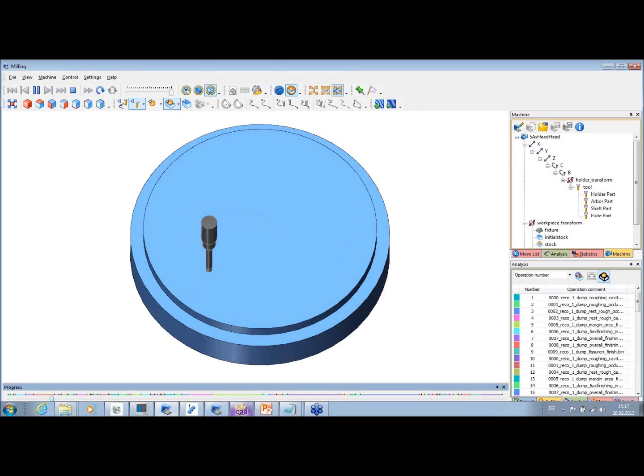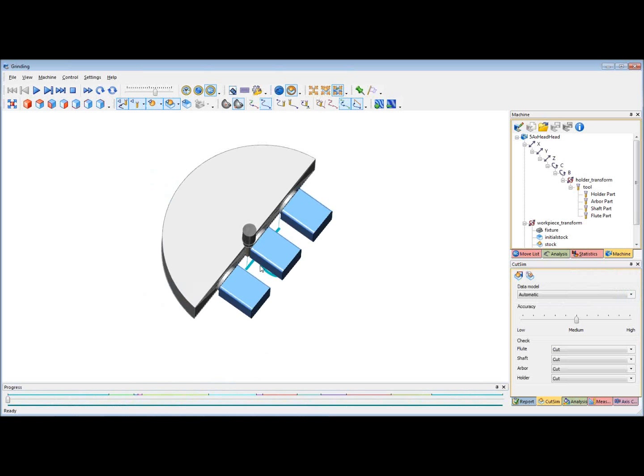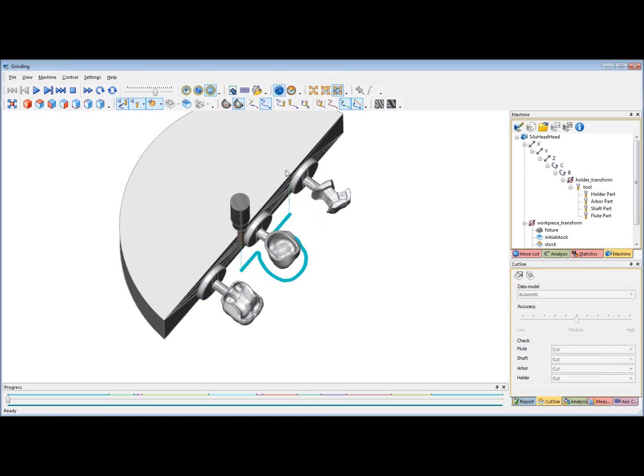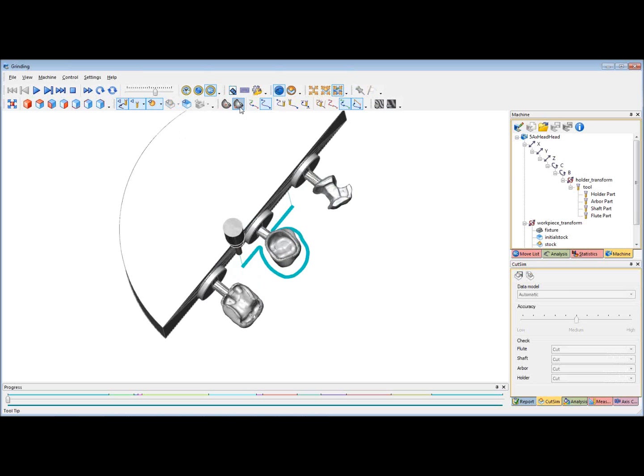While it's simulating, we'll have a look at the grinding toolpaths. We have developed a number of grinding toolpaths to mill glass ceramics, materials like Vita blocks or Emax, which can be ground using diamond coated tools. So we'll see different approaches here. We have 3 dental indications nested in 3 different positions.